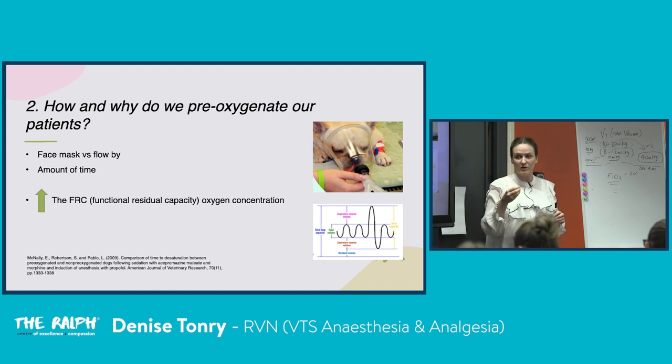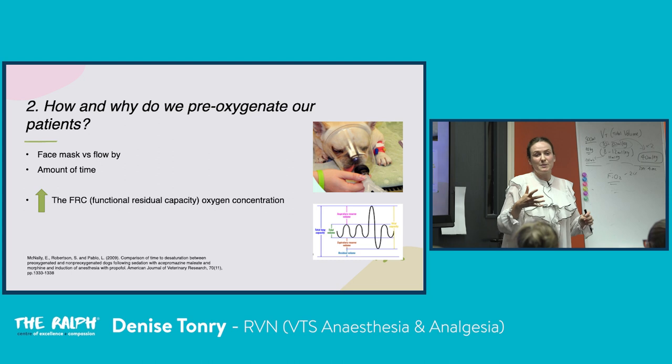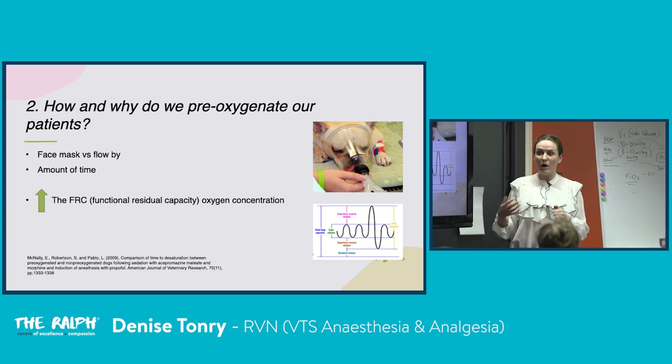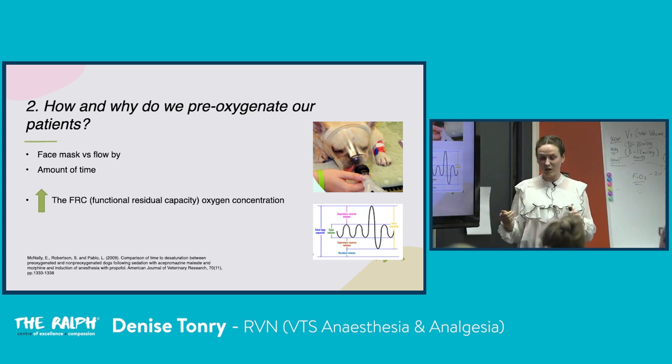And sure, it's coming out at 100%, but studies show maybe around 30%. We're bringing it up to around 30%. So from 21 to 30, it's better than nothing, absolutely. And a lot of what we do clinically is flow-by because they don't tolerate face masks.